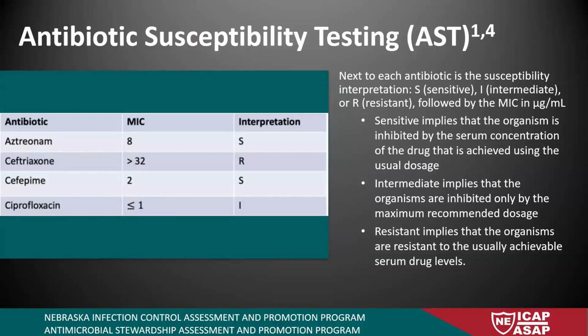And who sets these rules? Well, there's a group of people called the U.S. Clinical and Laboratory Standards Institute. I have more about that on the next slide, but they are a group of different people who decide this and review it frequently as organisms evolve. They update it all the time. And again, here's a graph that I stole from one of our infectious disease physicians, Dr. Hankins, from one of his presentations. Susceptible means that there's a high likelihood of therapeutic success for that drug to be used. Intermediate or indeterminate, uncertain, maybe not the best choice, and resistant means there's likely going to be therapeutic failure.